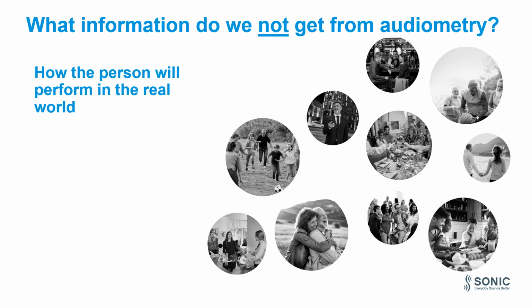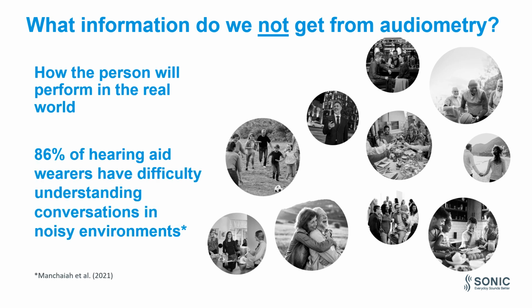Also, many studies throughout the years have shown that getting a good audiometry or hearing test result does not automatically mean that you can hear speech clearly in noise. In fact, a recent consumer study by Manchaiah and others in 2021 has also shown that 86% of hearing aid wearers have difficulty understanding conversations in noisy environments.